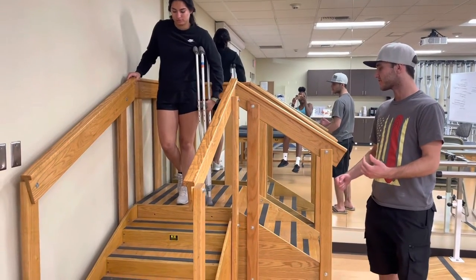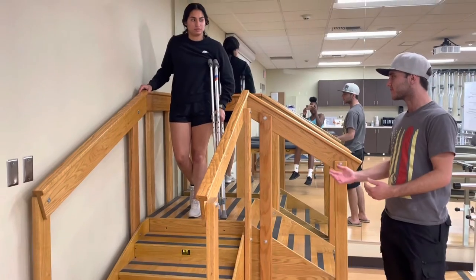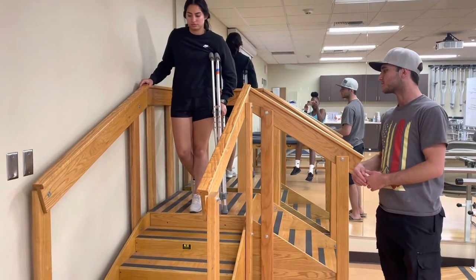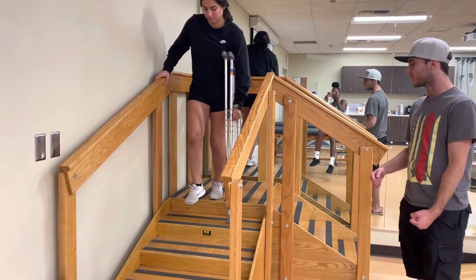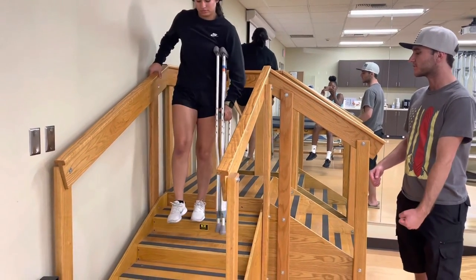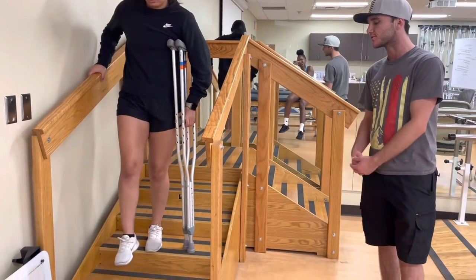When going down stairs, you want to make sure that you're leaning back a little bit so if you do end up falling, it's less of a fall backwards. You're going to start with the bad — bring the crutch down, then step down with your non-injured foot, bring the crutch down, step down with your non-injured foot, and so on until you get to the bottom.